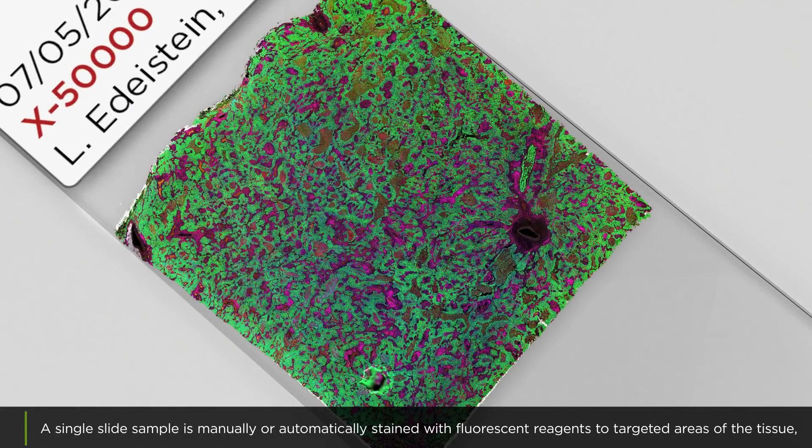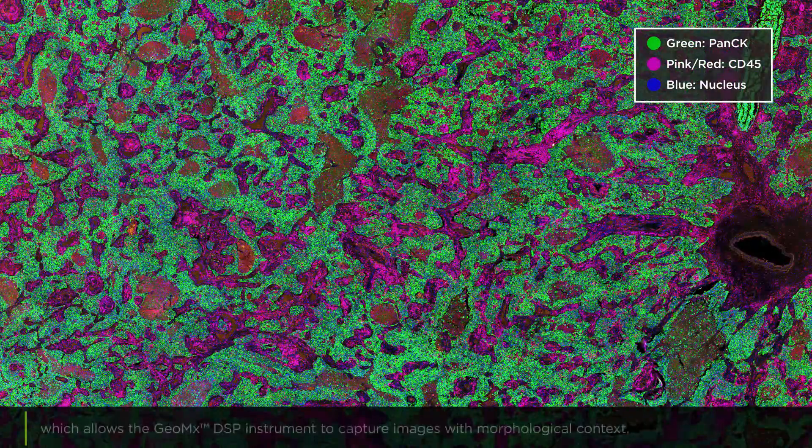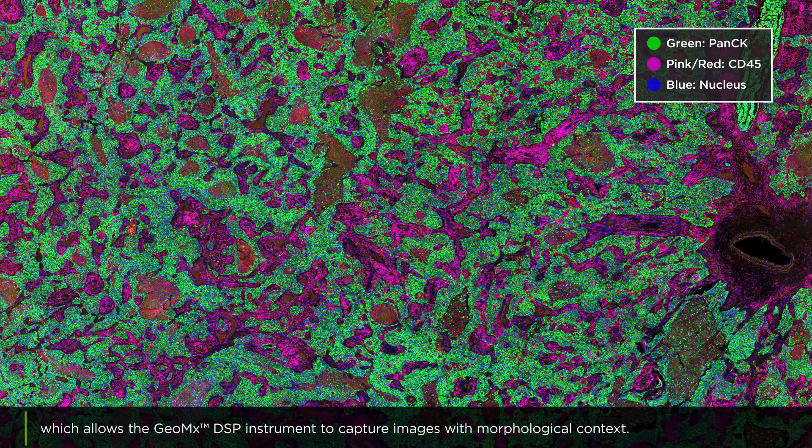A single slide sample is manually or automatically stained with fluorescent reagents to targeted areas of the tissue, which allows the GeoMix DSP instrument to capture images with morphological context.